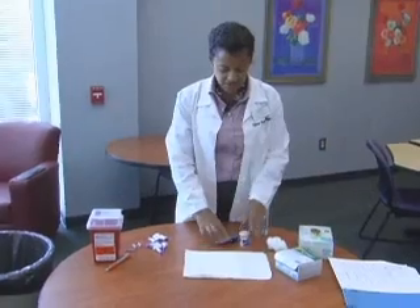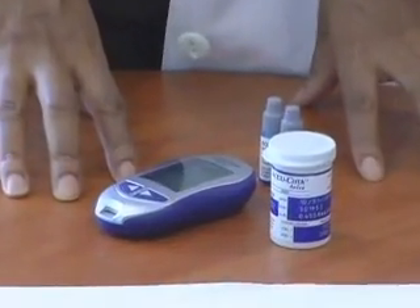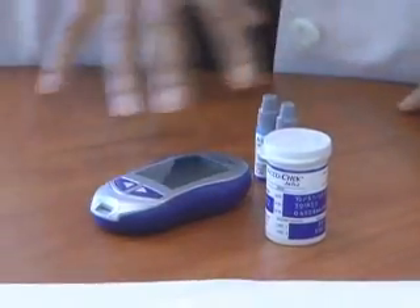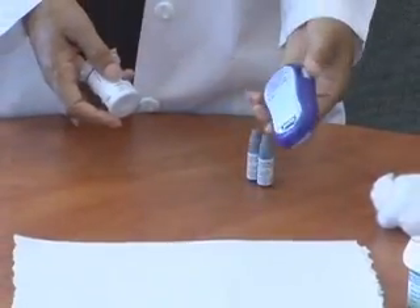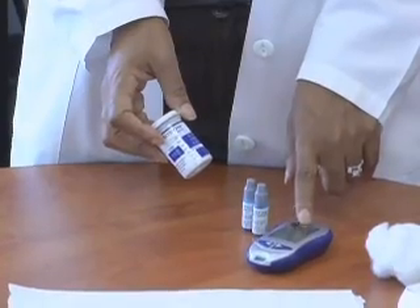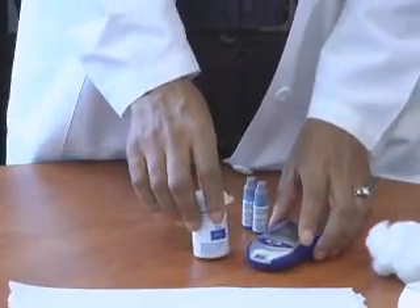This is the glucose meter. We have several types of glucose meters. The one we have today is the AccuCheck Aviva. OneTouch is also another very common brand, as well as Contour. You may be using any of those three brands, but for the purposes of this video, we're going to demonstrate on an AccuCheck monitor. Meters come with very specific test strips, so you must buy the test strips that go specifically with your meter. You cannot use OneTouch strips on an AccuCheck Aviva meter. So make sure you have the right test strips.